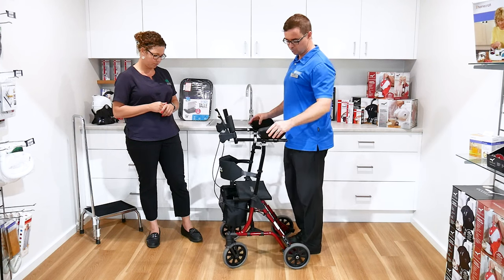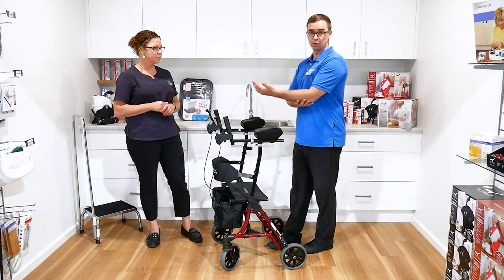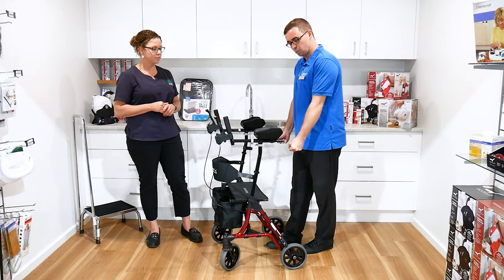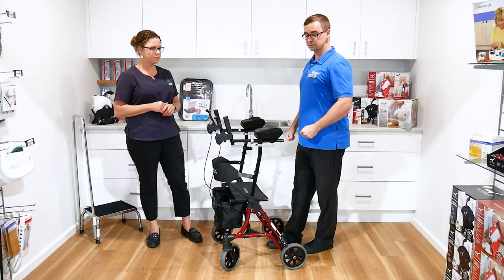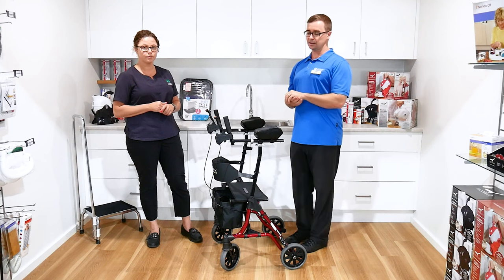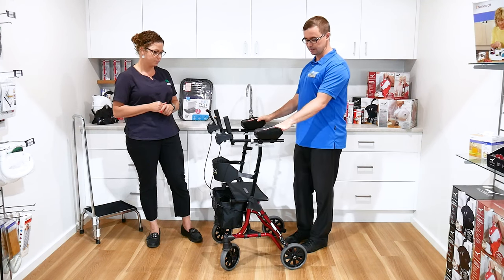Why would somebody be prescribed this walker over a four-wheel walker? They would be requiring more assistance through their arm, and pushing down on a walker all the time is not sustainable. It will typically lead to people having pain through their arms and their shoulders, so we would look at a device like this.